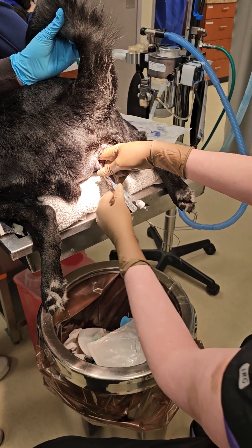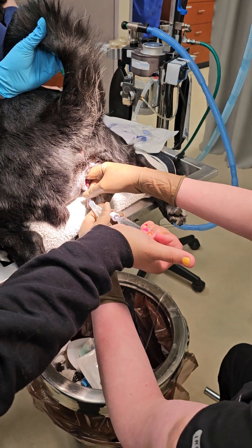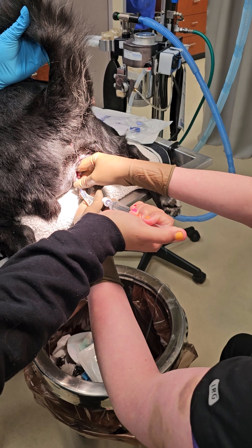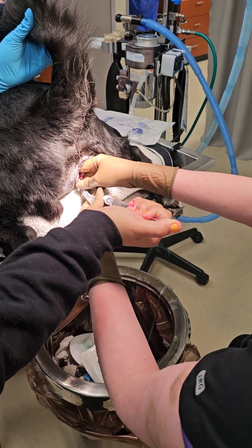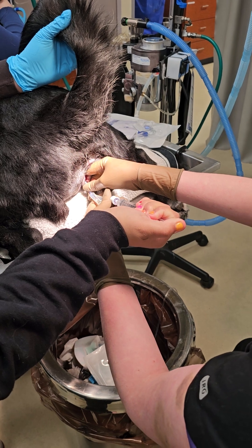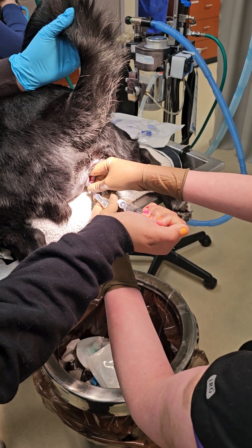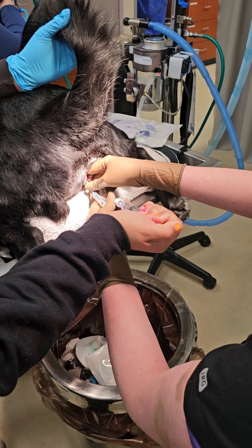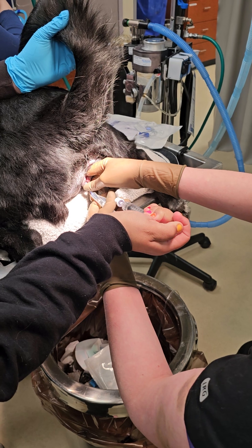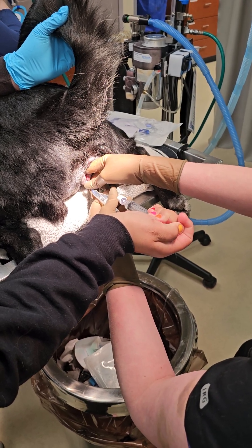Then you're going to have your person reinflate your balloon. The key is to make sure: does this feel exactly the same as you inflate the balloon as it did when you tested the balloon? You're going to inflate the balloon, but I do want you to not do that last half mil. The reason is I've had a couple of 10cc balloons that I've put 10ccs in and they've actually ruptured. So when I'm doing a 10cc urinary catheter balloon, I tend to go just half a mil shy.